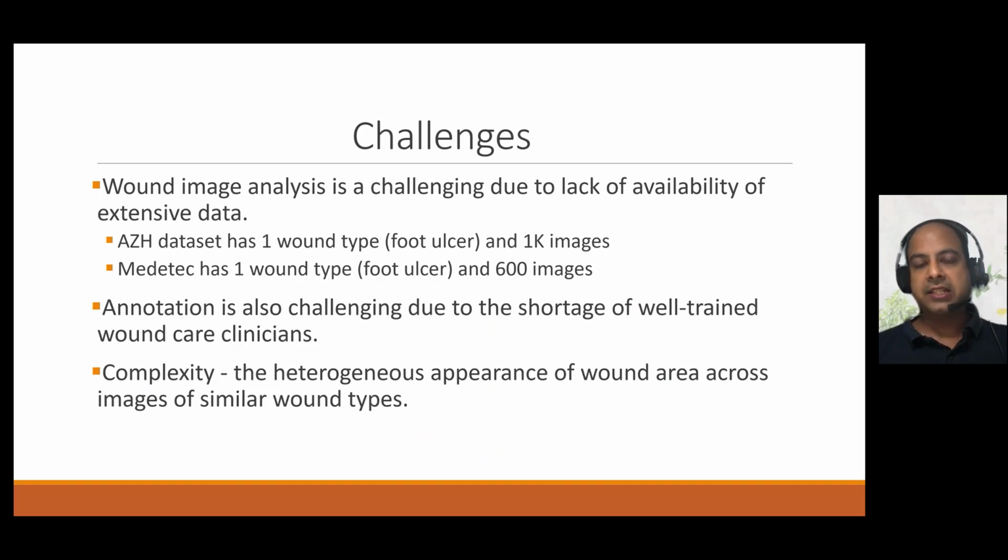The wound segmentation task is challenging. In fact, wound image analysis is itself challenging due to lack of availability of extensive data. The AZH dataset has just one wound type, while Medetec is another dataset with just one wound type, foot ulcer, and the datasets are pretty small, 1K or 600 images in size. Annotation is also challenging due to shortage of well-trained wound care clinicians.